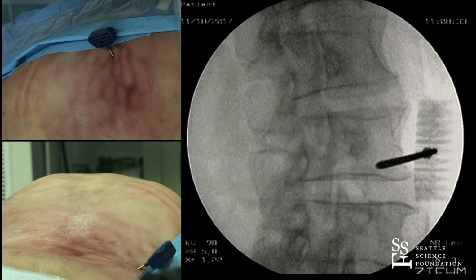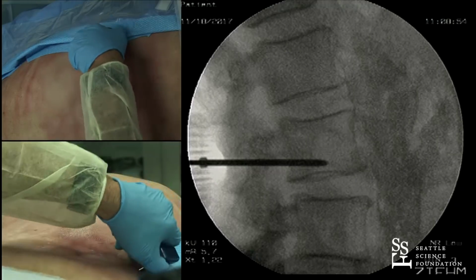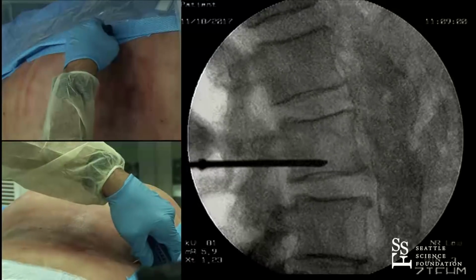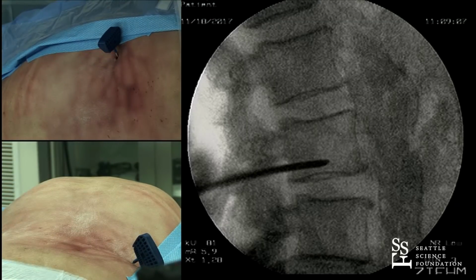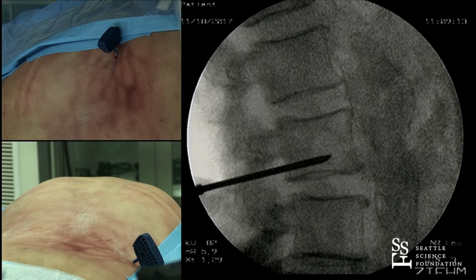And we'll get our trajectory, take a good look at it, and we'll take an AP shot after this. And so this is a nice trajectory. But I want to come up. I'm going to use the bevel of the needle to angle it slightly superior just because we like style points. Right, Jason? Yep. Okay, so I like that mid-anterior portion. And we'll take an AP shot, and we should be roughly in the mid portion of the vertebral body.